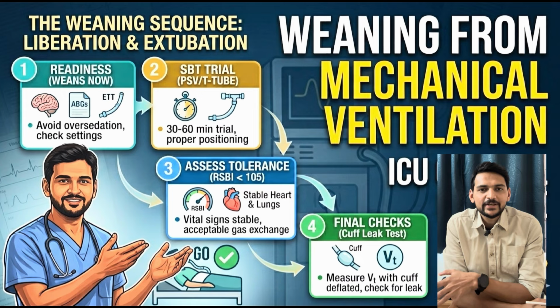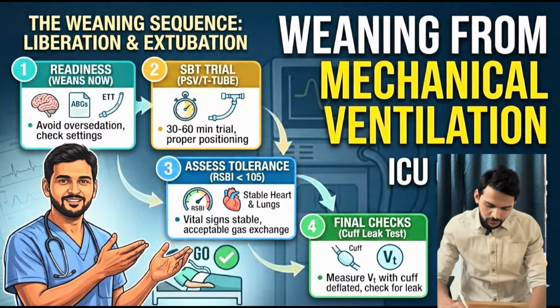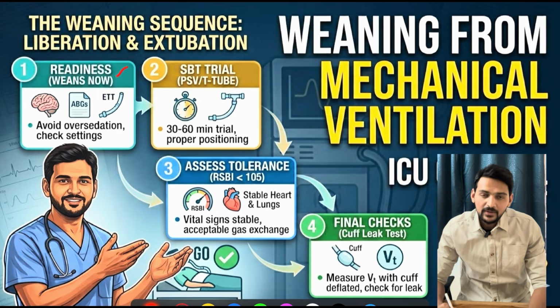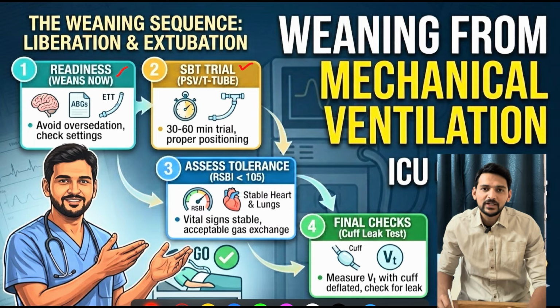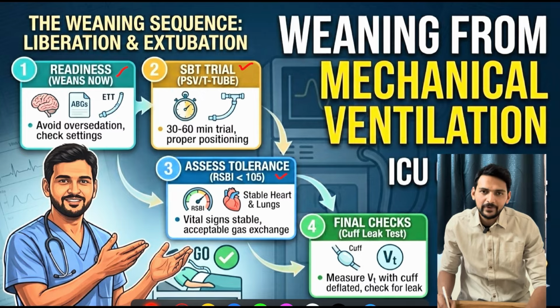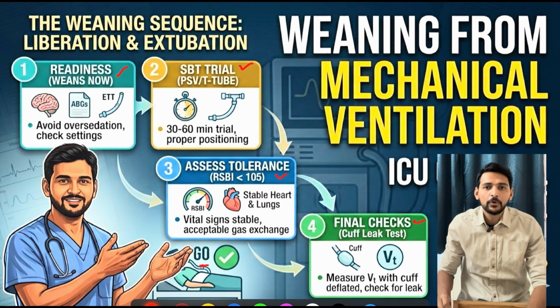Just follow through this lecture so that you will get to know what you were doing was actually right and where you can improvise. Mainly when it comes to weaning, first we have to check whether the individual is ready to wean or not. Then once we feel the individual is ready, we will give something called a spontaneous breathing trial. Once the patient has undergone that trial, we will assess whether he or she has tolerated it or not. Suppose the individual tolerates it well, then there will be a final checklist which we will do before moving ahead with the weaning process. So all these components we will be discussing.